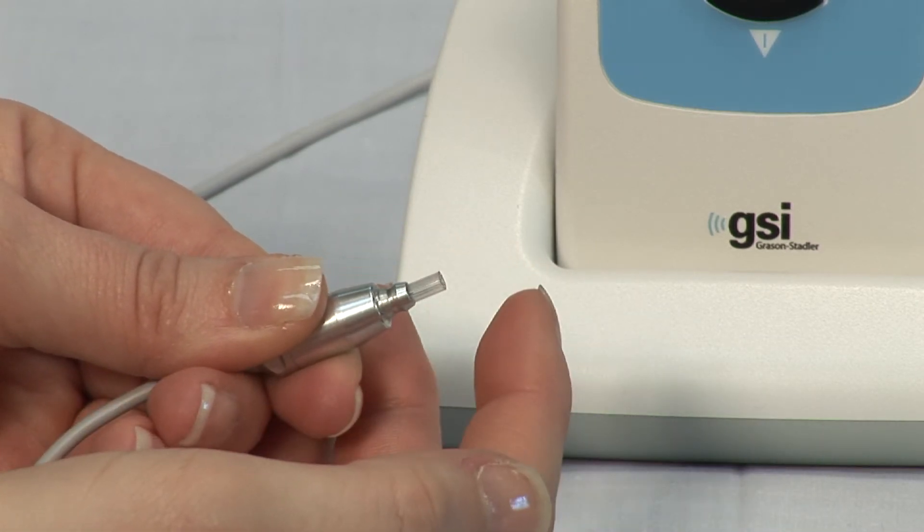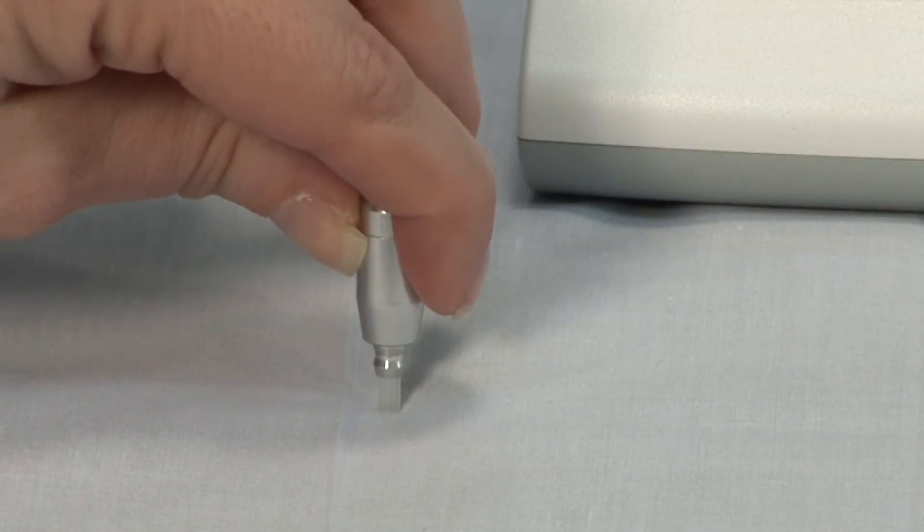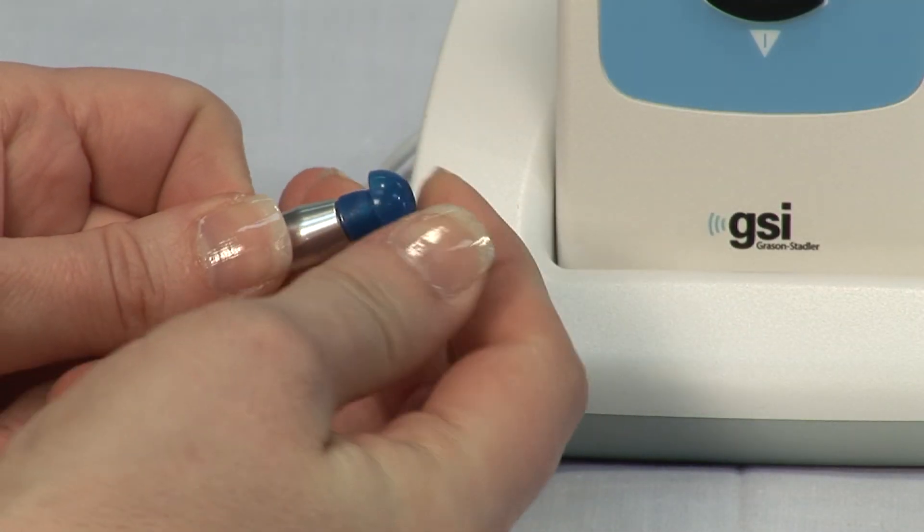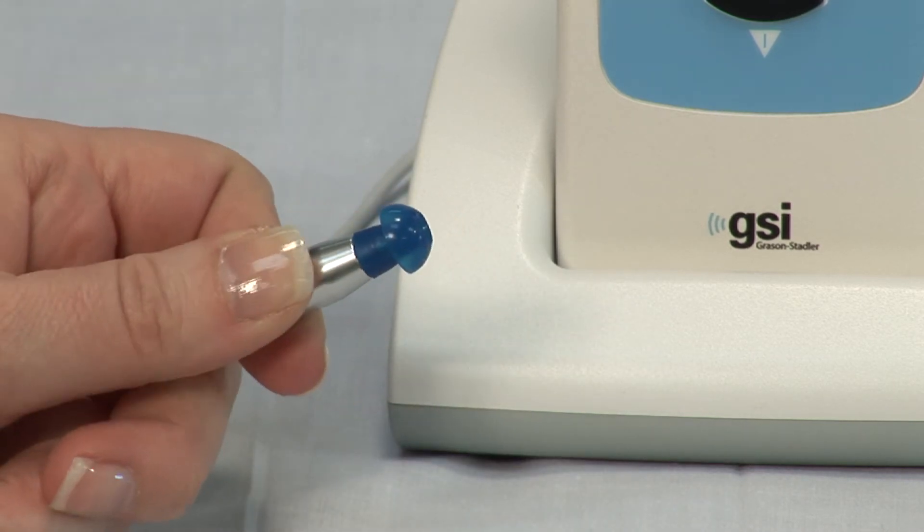Press the probe tube against a hard surface until it snaps into place. Place a new ear tip on the probe until it meets the collar of the probe body. You are now ready to test your patient.